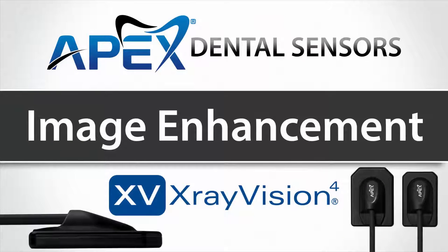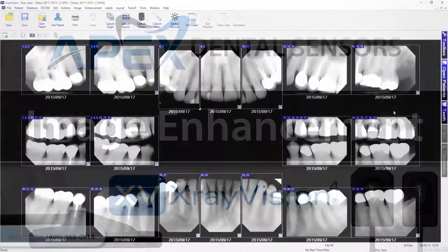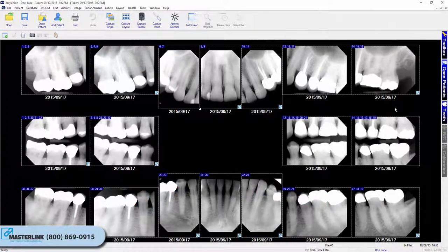Image Enhancement. X-Ray Vision's Image Manipulation and Enhancement tools enable users to improve image quality without having to reshoot x-rays or other images. This portion of the guide will highlight the primary enhancement tools.